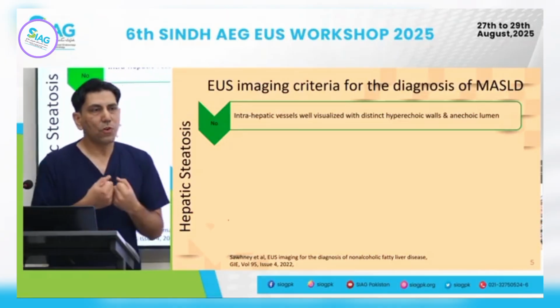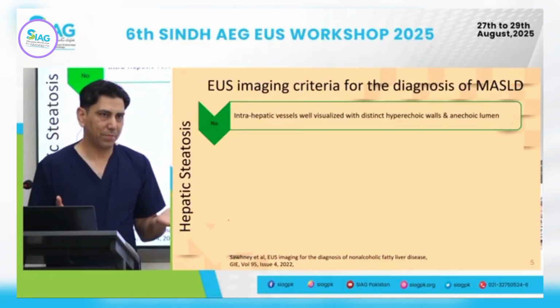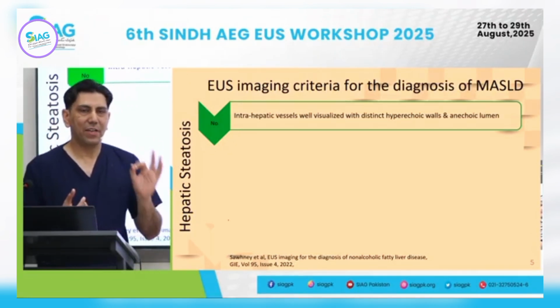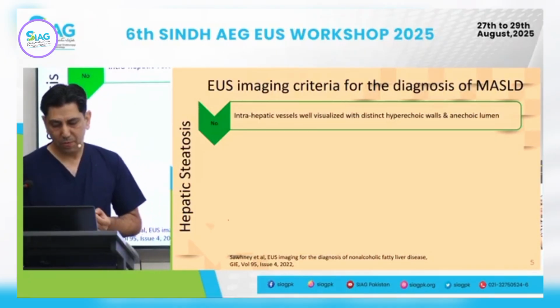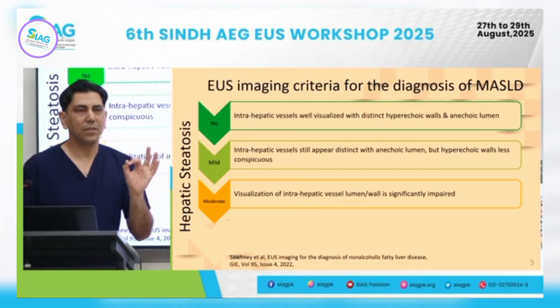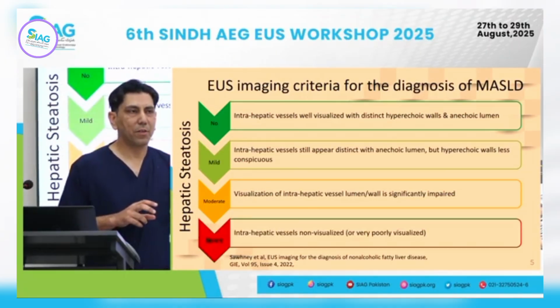Okay. One of the commonest problems all over the world is fatty liver disease, steatosis. So purely by just looking at the liver parenchyma and the vasculature, we can do a subjective assessment. We can look at two things: the vessels, their caliber, how uniform it is, and how thick or prominent the walls are.